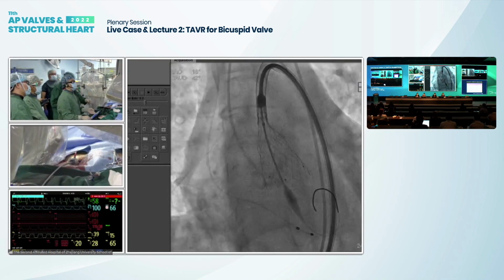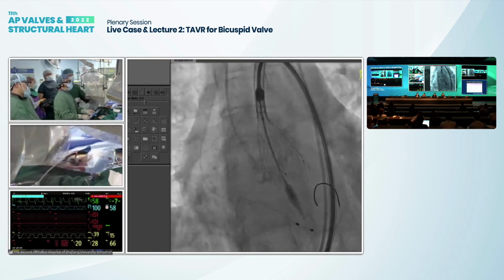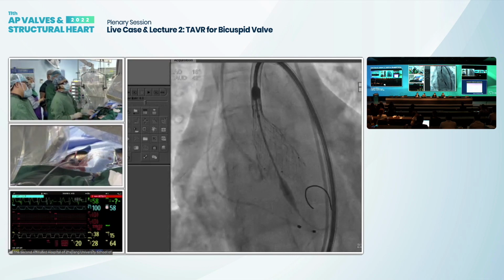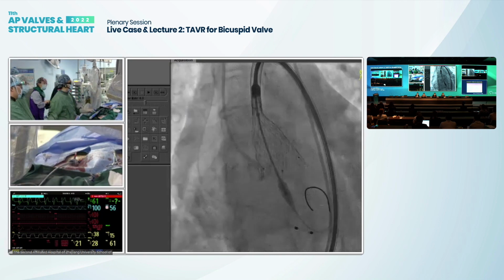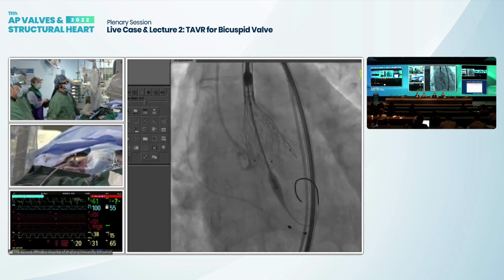So push in a little. Okay, this position is still acceptable. Maybe just check that and see what it looks like. This position is hard to shoot. Very hard to have a very good projection of X-ray. Yeah. Very hard to achieve a good projection.